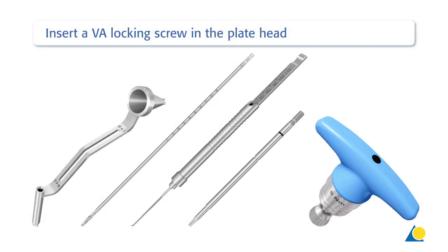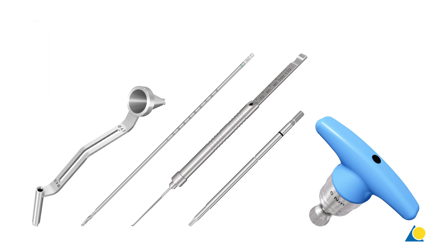The instruments needed to insert a variable angle locking screw in the plate head are the 4.3 mm variable angle double drill sleeve, the 4.3 mm calibrated drill bit, the depth gauge, the T25 star drive screwdriver shaft, and the T-handle with torque limiting function 6 Nm.